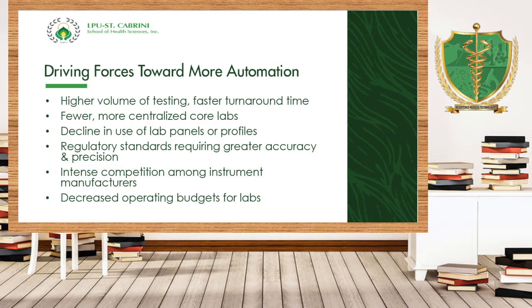And I still remember my question to you, why is it that turnaround time in the clinical chemistry section ay mahaba? No? Clinical chemistry section yung isa sa pinakamahabang turnaround time. Well, of course, except for microbiology section, which can be as long as 7 days, depending on the program or the culturing method na gagamitin. While in chemistry, we have a long turnaround time or approximately 2 hours turnaround time.